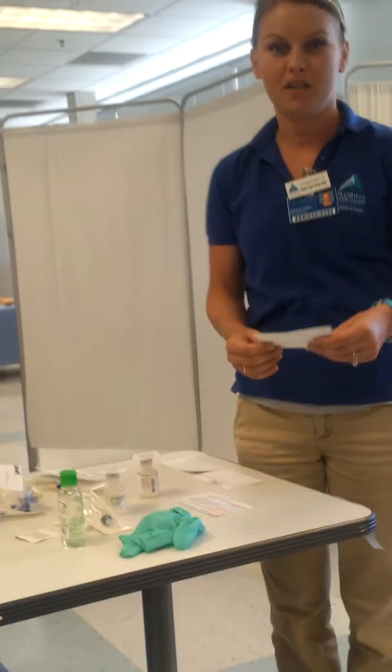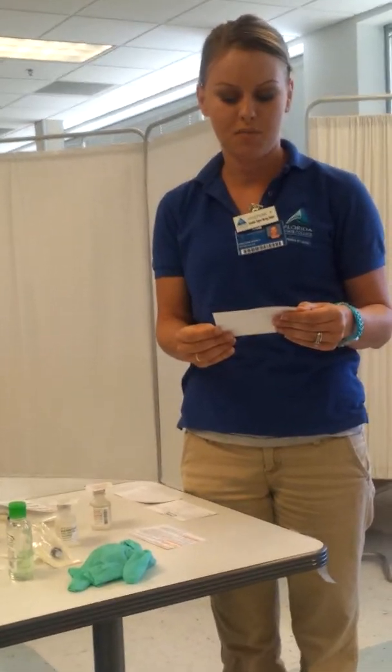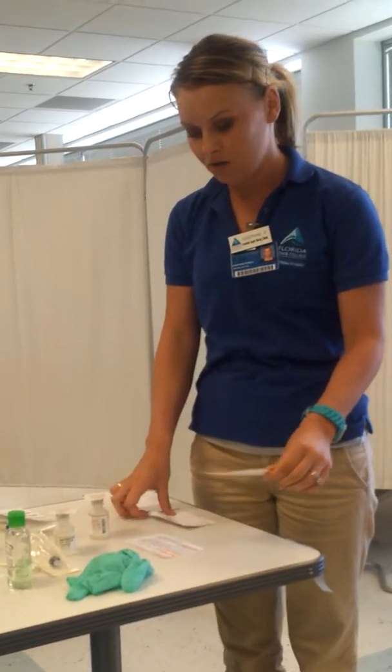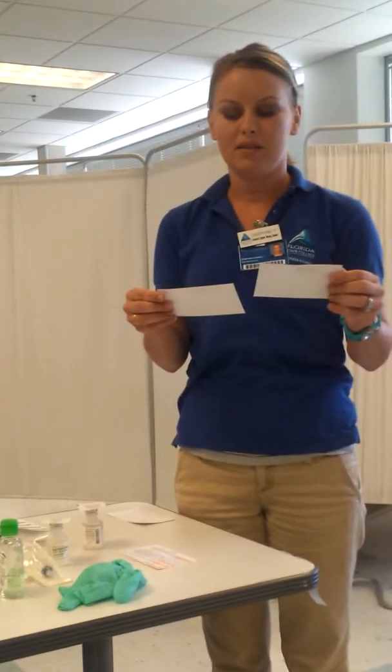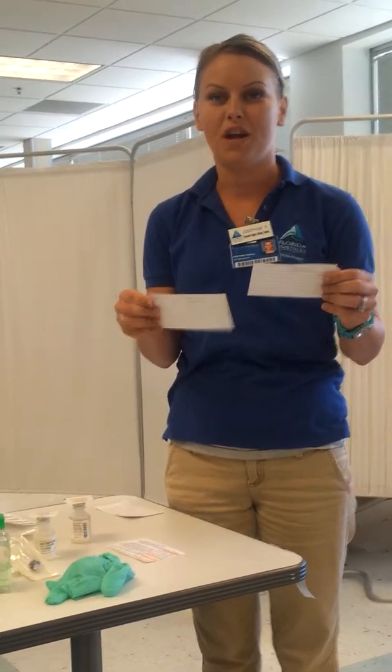The first thing I'm going to do is check my doctor's orders. I see here that my doctor has ordered vancomycin 500mg mixed in 100ml of sodium chloride every 6 hours. I'm going to check that up against my MAR, and on my MAR I have listed vancomycin 500mg IV in 100ml of sodium chloride every 6 hours.